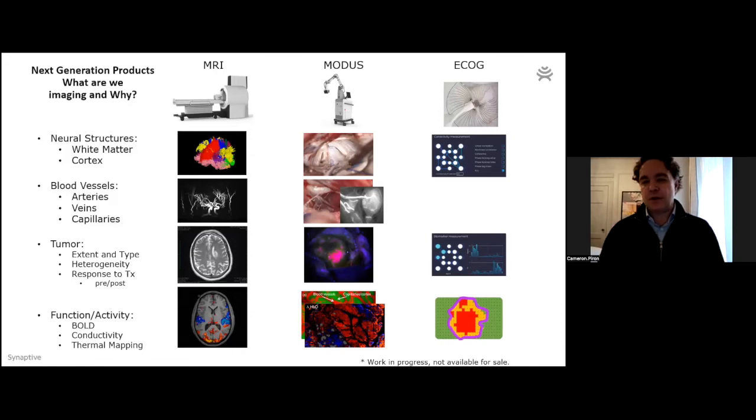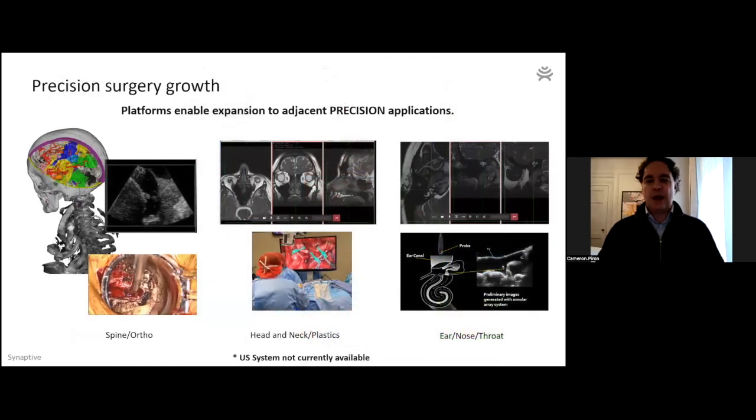And we have a phenomenal partnership forming with a group at the Rothschild Institute in Paris, France. They'll be using this to look at the margin of the tumor. So when you think you've removed all the tumor, you can lay this in the cavity and electrically excite the boundaries of it. What they found is that there's an epileptic signature in areas where the tumor is still invading. So we want to push that boundary to be able to do these resections more safely and more effectively. And it's great to not just develop technologies internally, but to have partners like Panaxium. That's a research project, but I'm really excited about expanding our application set.